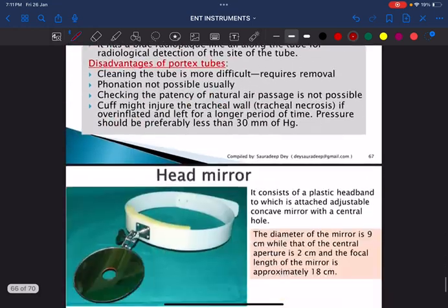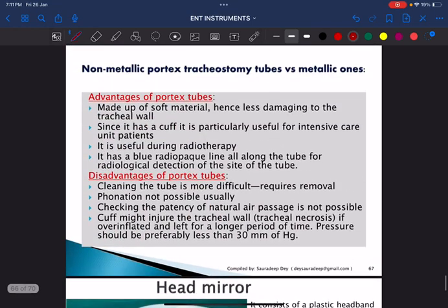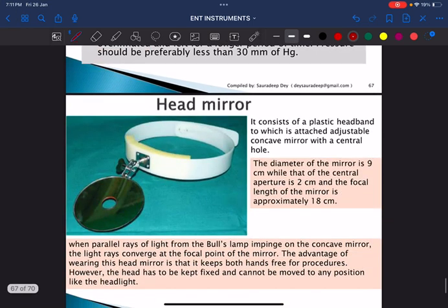This is the head mirror, mainly used by ENT surgeons to get a proper view of smaller structures. It consists of a plastic headband, and the important exam question is: what type of mirror is present? It is a concave mirror with a central hole.